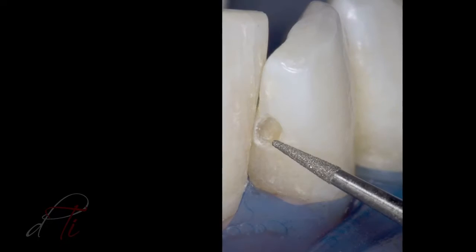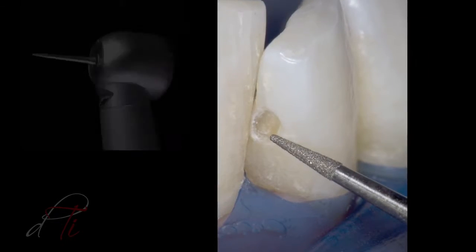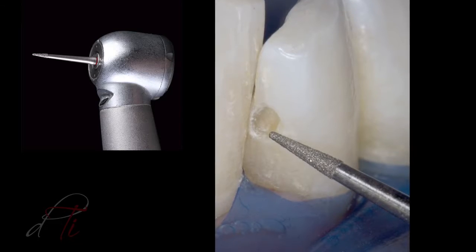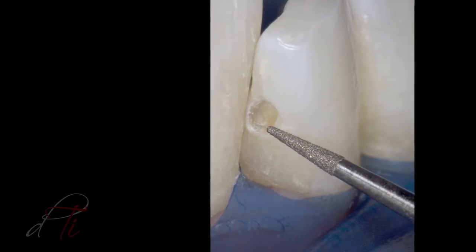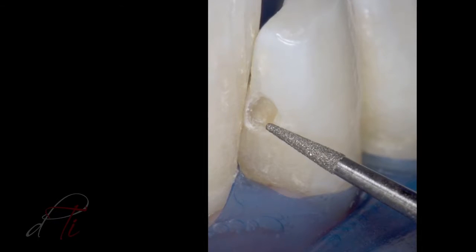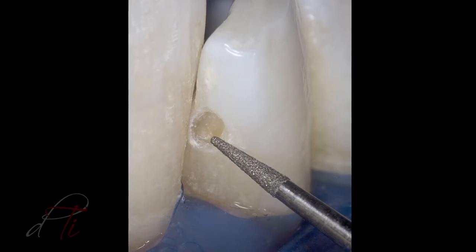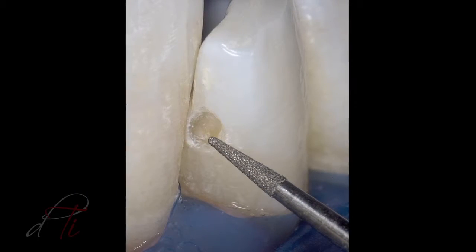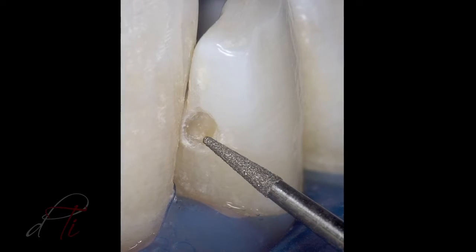A circumferential bevel is placed in enamel using a tapered diamond burr, a DET3 by Brassler USA. An enamel bevel is indicated because it increases the surface area for end-on etching of the enamel rods for an increased etched surface, which results in a stronger enamel to resin bond, increases the retention of the restoration, and reduces marginal leakage and discoloration.